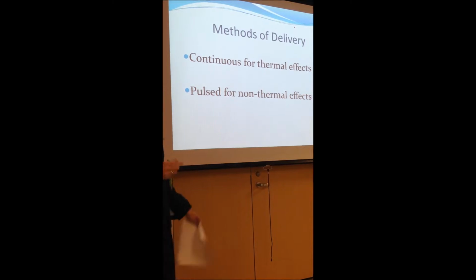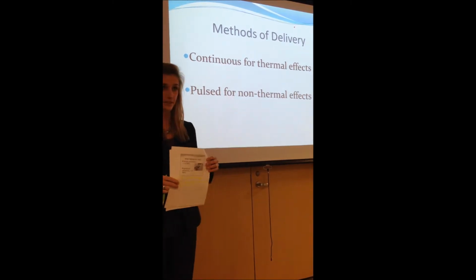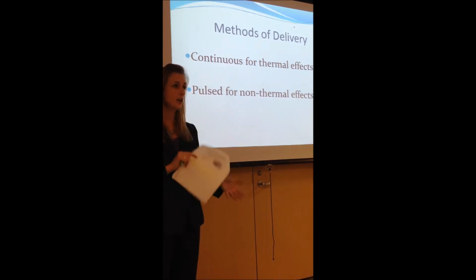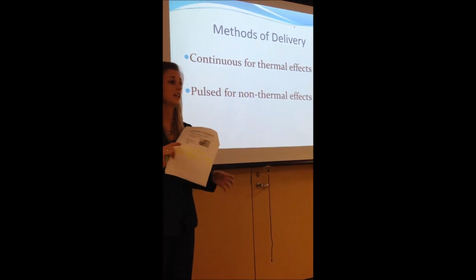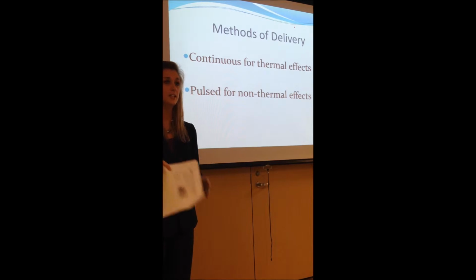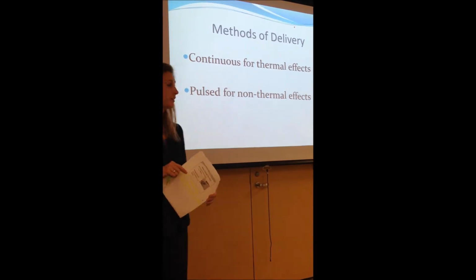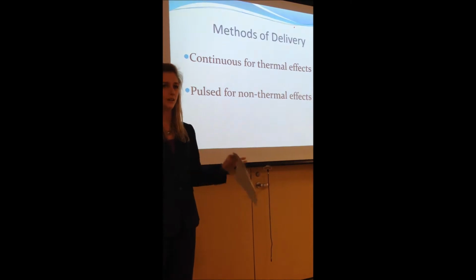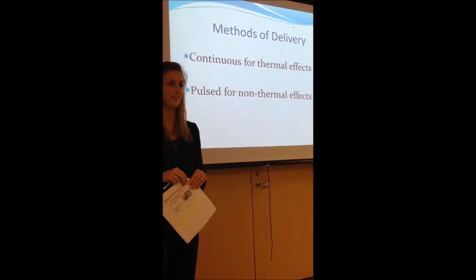Methods for delivery, we're mostly going to do the continuous. We want the thermal effects. We want the deep heat to the area to calm down the tissue so that we can eventually get some stretching or mobilization to achieve some functional goals. The pulsed mode doesn't have thermal effects, so we are not going to want that.